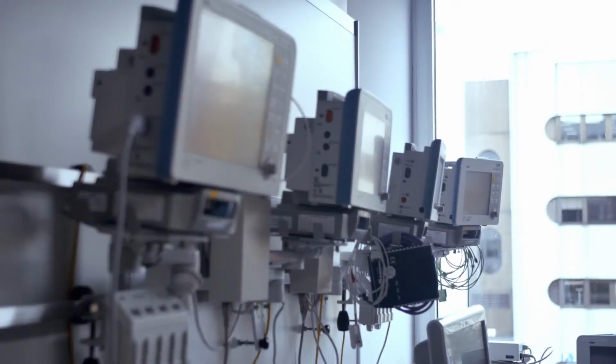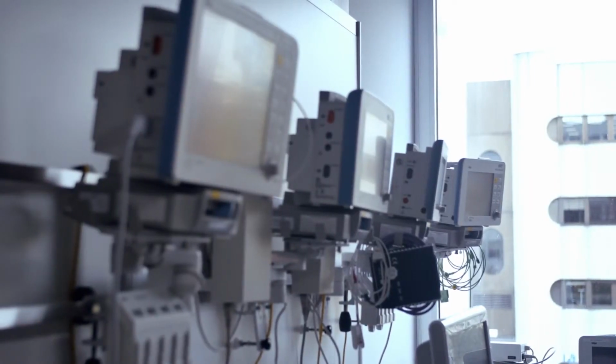When we look at sending the information directly to the information system, which is on the server, we use a proprietary protocol, which is the Dräger Infinity network. The data collection is the big data.